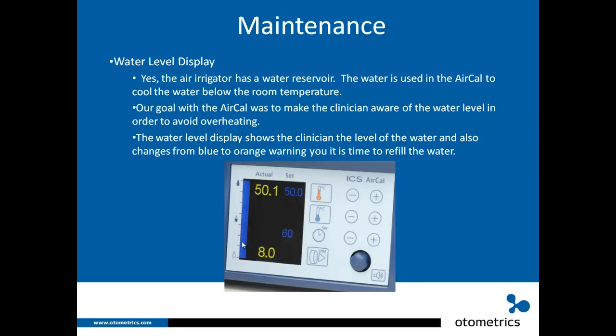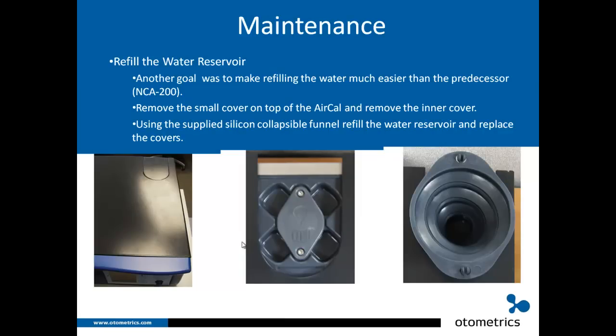We also wanted to make refilling easy. You remove the small cover on top of the AirCal, then remove the inner cover which has rubber rings for a suction fit. Using the supplied silicone collapsible funnel, you pop it open, slip it in, and pour in the water, then replace the covers. Always use distilled water in an air irrigator — or even your water irrigator. That's very important.